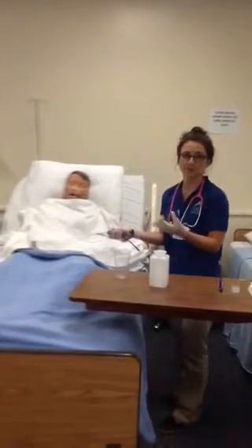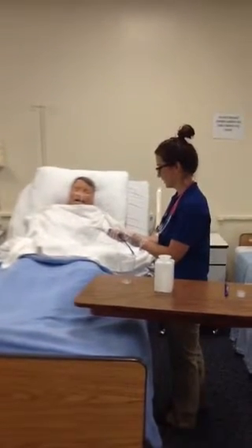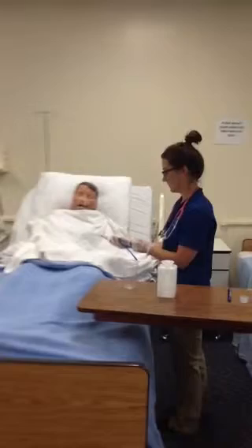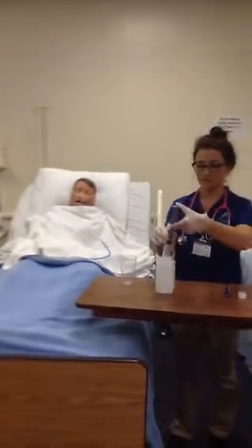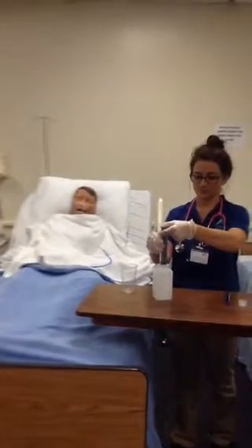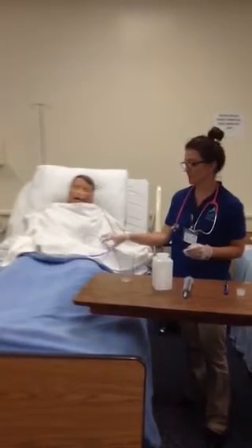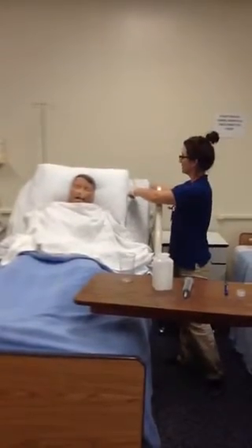So now I'm also going to withdraw the 30 milliliters of normal saline that I've inserted into the stomach. Okay, and now I'm going to discard. Okay, so then now I can go ahead and place the patient's suctioning nasogastric tube back to the suctioning device.